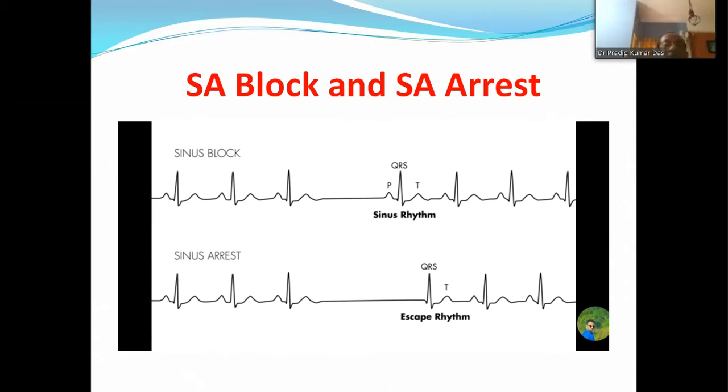So if we interpret these two carefully, if you look at the rhythm beat after the pause, you will easily find whether it is arrest or block.